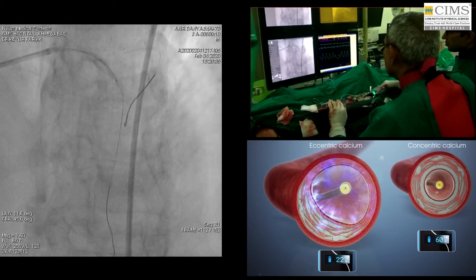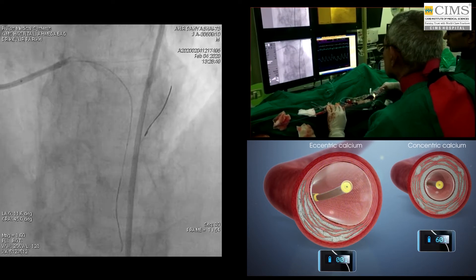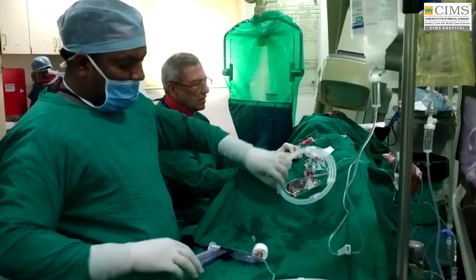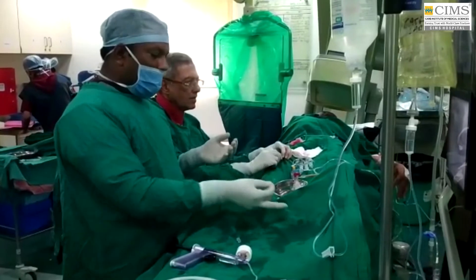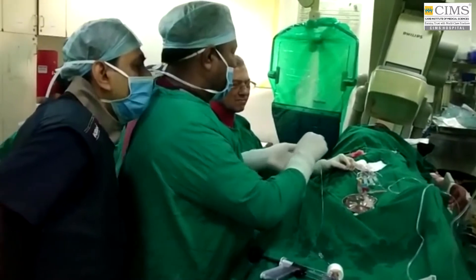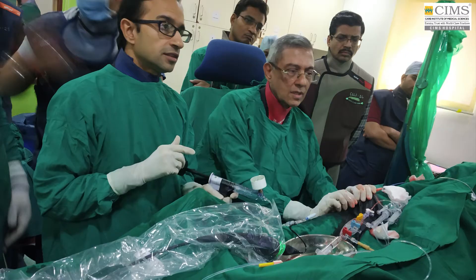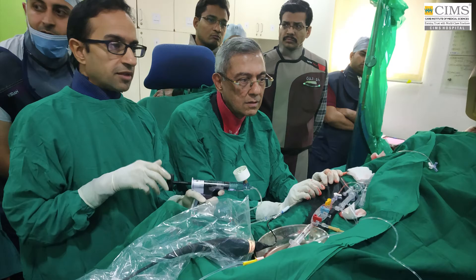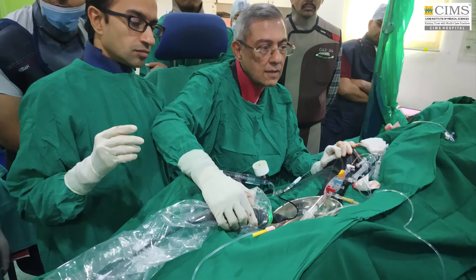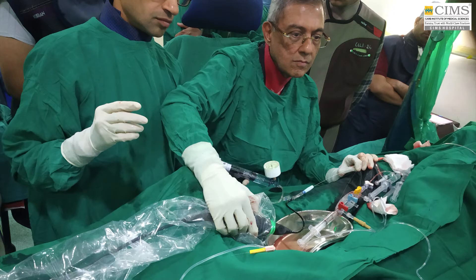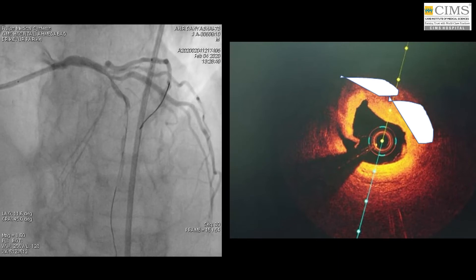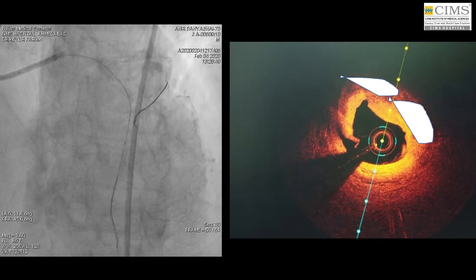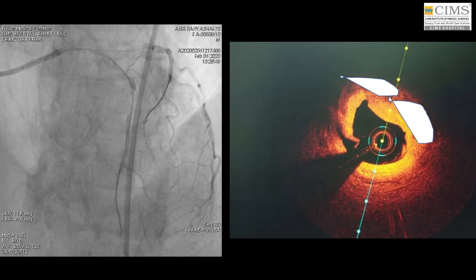Regardless of how much energy is required, the efficacy of the shock waves is evident under angiography. We now advance the OCT — Optical Coherence Tomographic Catheter by Abbott — across the lesion. We had tried to advance the OCT earlier but were unable due to heavy calcium. As you can see, the OCT catheter is now advanced easily. Dr. Vipul Kapoor has moved to the OCT console to guide interpretation. We are now going ahead with the OCT imaging, and I will pass it to Dr. Vipul Kapoor to explain the OCT findings. This is the OCT catheter advanced across the image, going across the distal portion of the lesion.